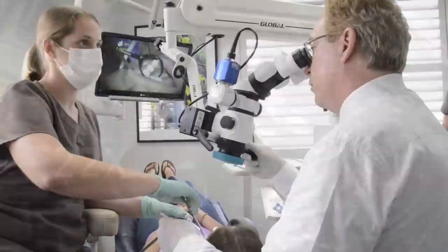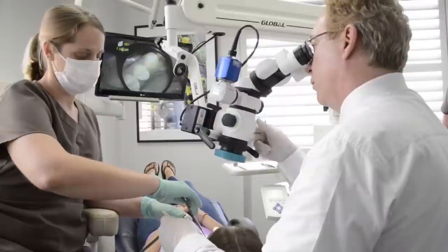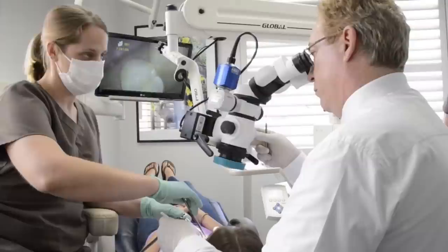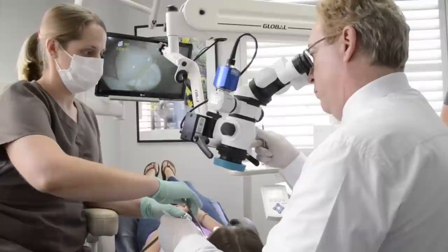Let me show you a few examples here of the scope. There's a monitor above the patient. That was at 2.5x. This is 3.5x. This is 5.5x. This is 9x. This is 14x. Should I want to show the patient something, they can also see what I'm looking at. And this is 22x.